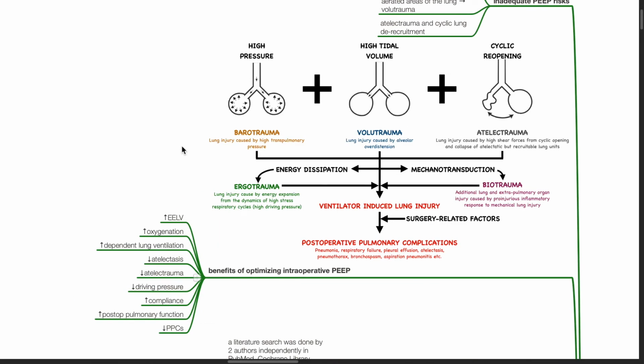Benefits of optimizing intraoperative PEEP. There is increase in EELV, increase in oxygenation, increase in dependent lung ventilation, reduction in atelectasis and atelectrauma, reduction in driving pressure, increased compliance, improved post-op pulmonary function, and reduction in PPCs.